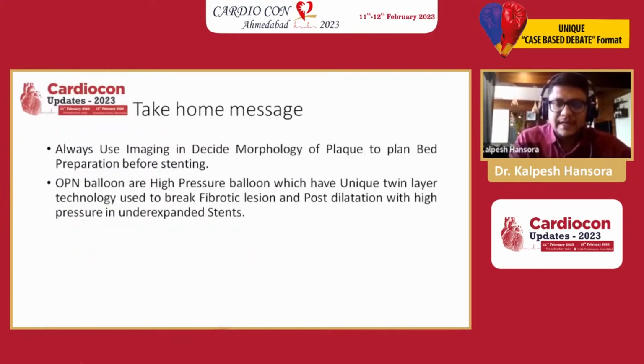So ultimately we did the PTCA stenting, and we pre-dilated and post-dilated with the OPN balloon. The take home message is to always use IVUS imaging or OCT imaging to decide the morphology of the plaque, so you can plan for the bed preparation before stenting.